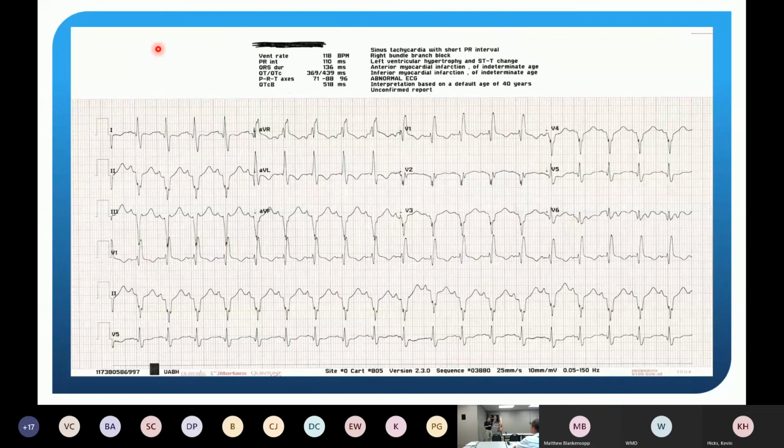I agree. And you're right, post-arrest you're going to have changes in that EKG. That heart is reperfusing, you get dysrhythmias, all kinds of things, plus trauma, plus CPR. But the good thing is, I hate to say it this way, you may get lucky and it will be a blatant STEMI post-arrest, then there's no doubt they go to the cath lab.